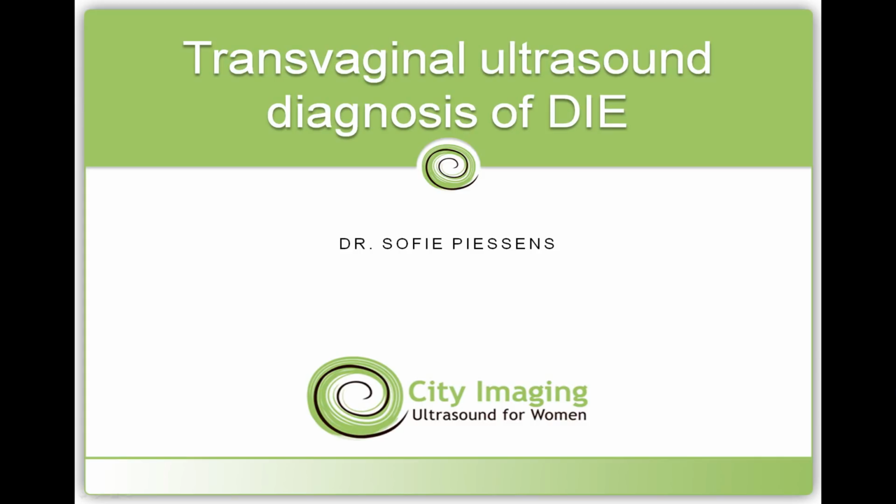This is the second in a series of tutorials in which I like to demonstrate how to diagnose deep infiltrating endometriosis with transvaginal ultrasound.